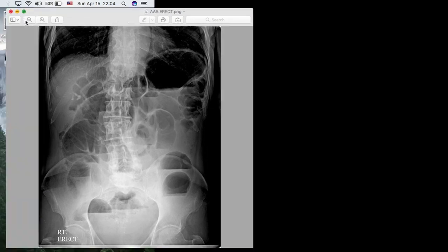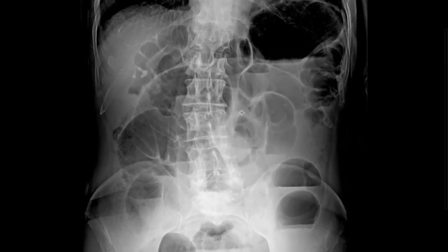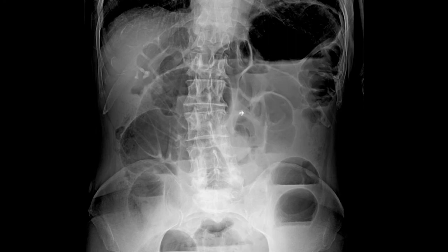Alright, now when a radiologist or a radiology doctor measures the bowel to indicate if there's bowel obstruction or not, there are specific values. We have the 3-6-9 rule. Okay, remember that 3-6-9 rule. It's very useful to guide you in determining whether these bowel loops are normally dilated, like it's just gas within the bowel, or it's abnormally dilated to the extent that you have to diagnose it as a bowel obstruction.